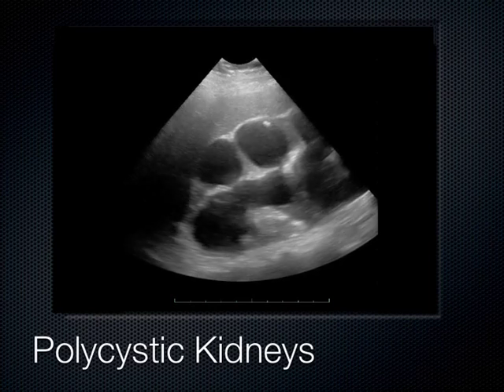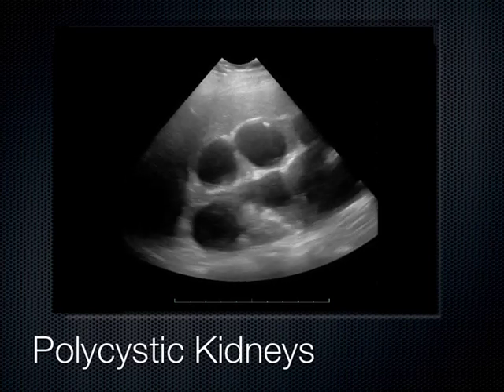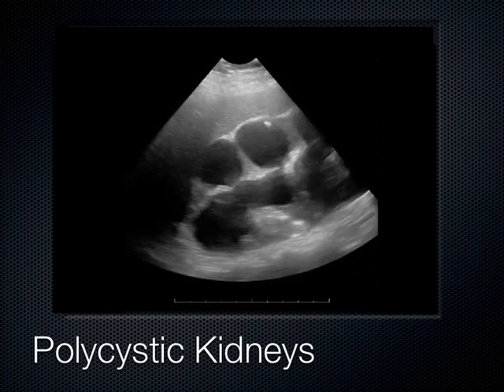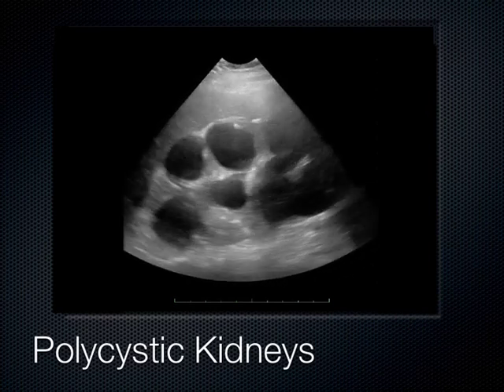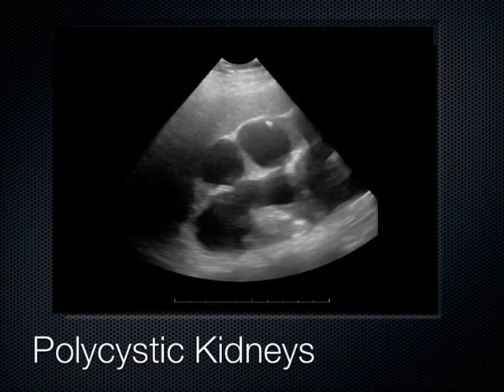You heard of polycystic kidney disease? This is what it looks like on ultrasound. These are all these cysts seen out here in the cortex. We can make that one here, this one here, this one here, this one down here. Polycystic kidneys, and it's bilateral.